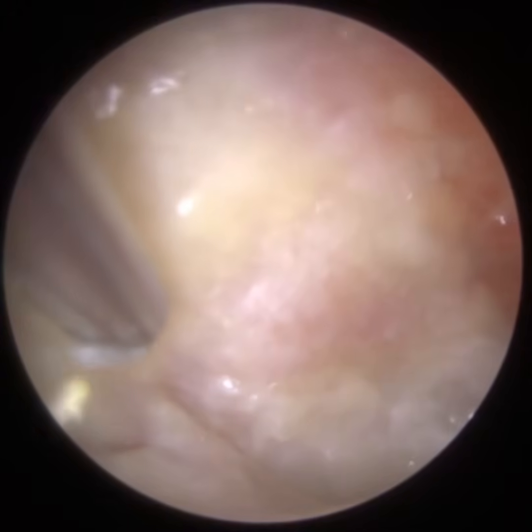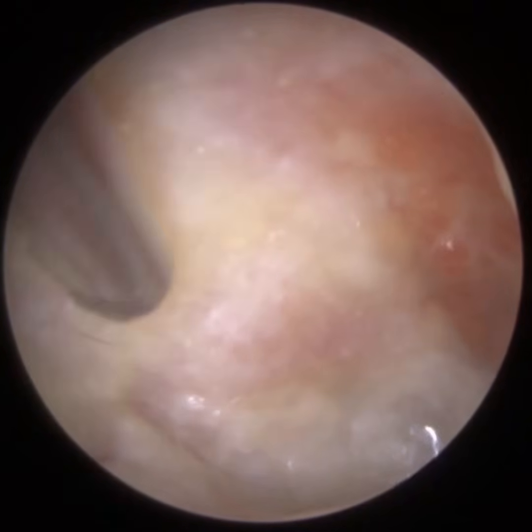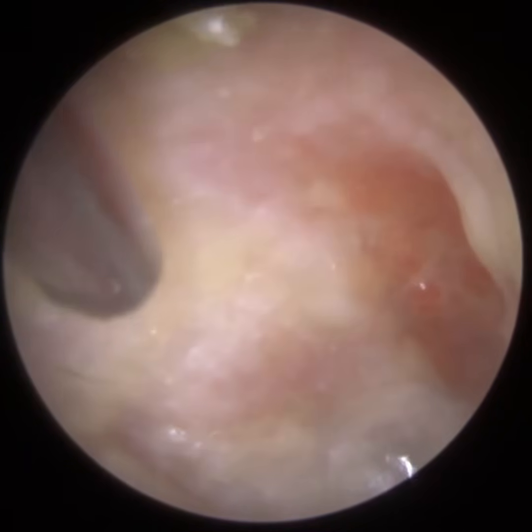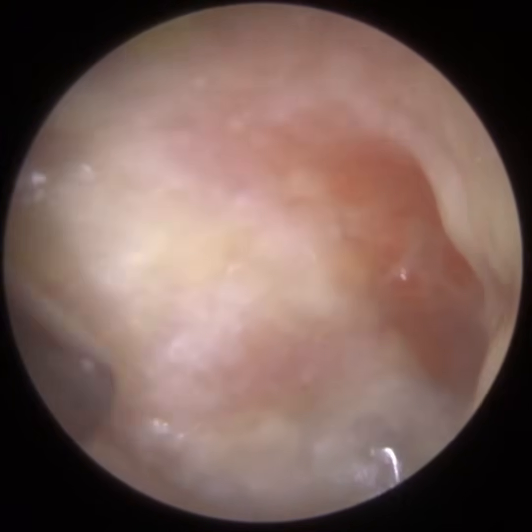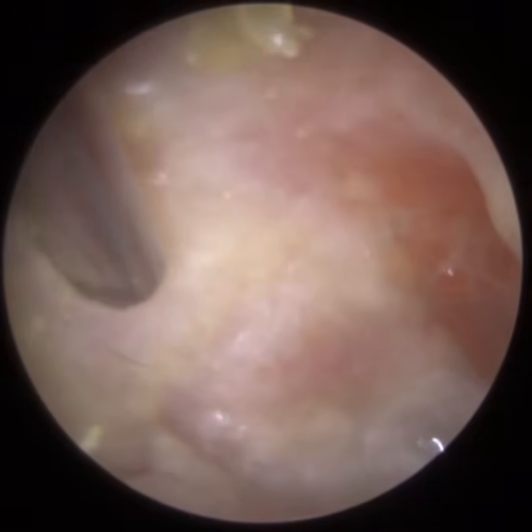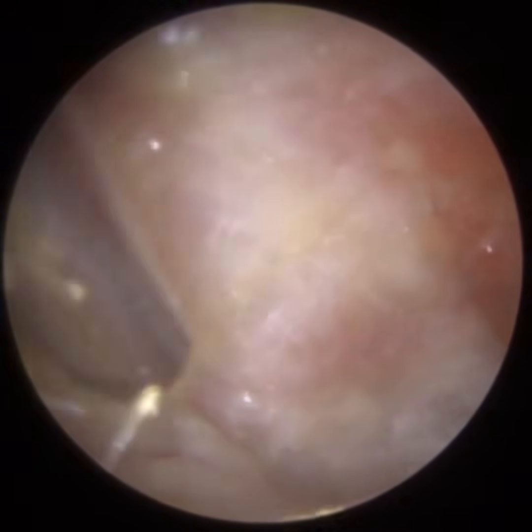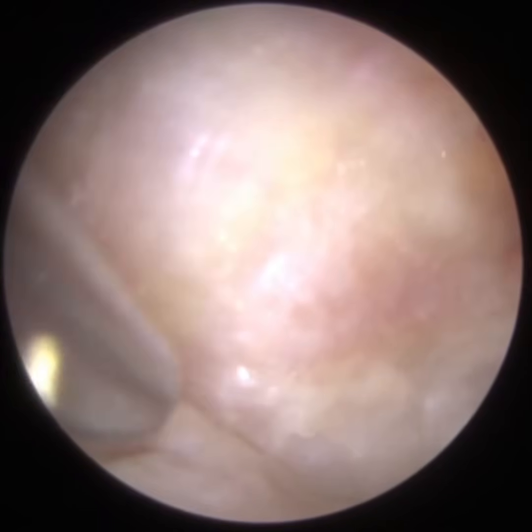Sometimes with dead skin like this, you just hover the suction probe over the eardrum, and this dead skin just comes out. But in this patient's case, it doesn't. We have to actually go through the process of peeling it. So getting the edge of the dead skin, finding that first, and then peeling it away.